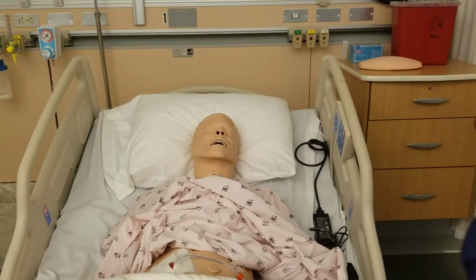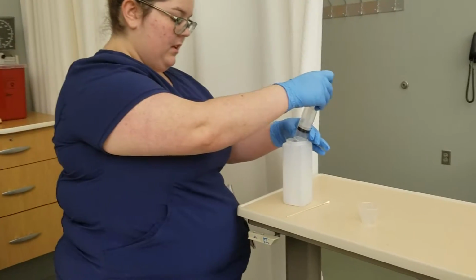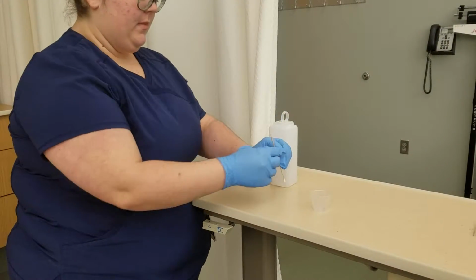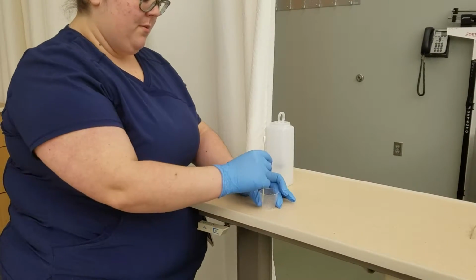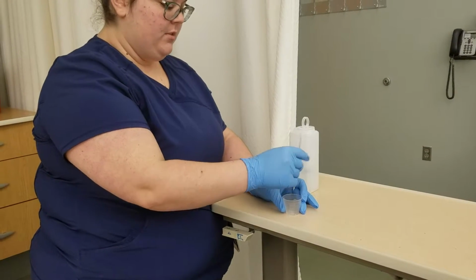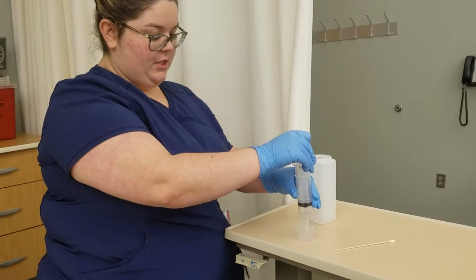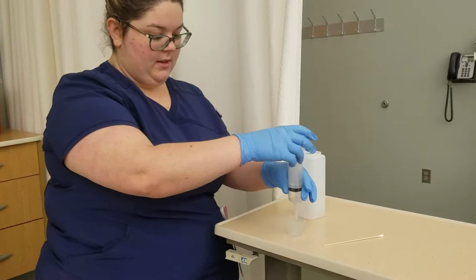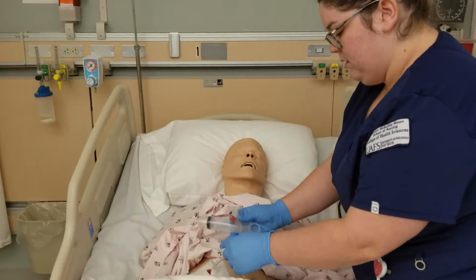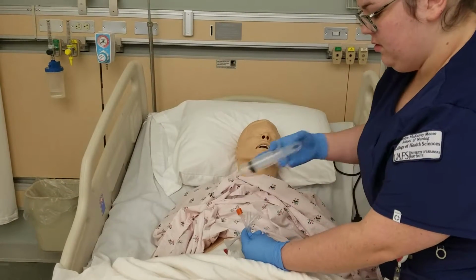Now I'm going to mix water with my medication. I'm going to also draw up 20 milliliters of water. I'm going to put it in with my medication. I'm going to mix my medication up, making sure there are no clumps so that it doesn't occlude the line. I'm going to draw all my medication up, and then make sure I've got the syringe attached to the tube.